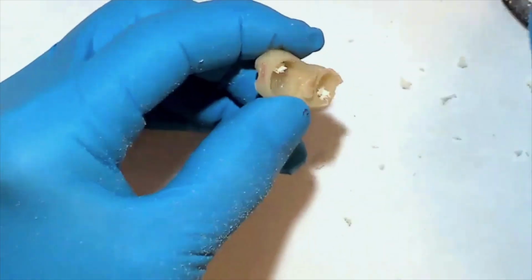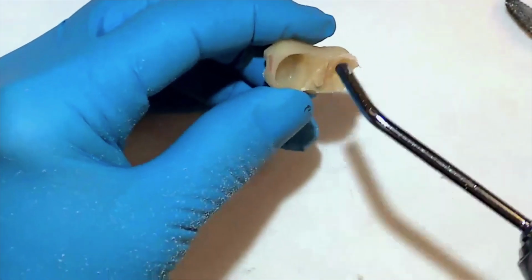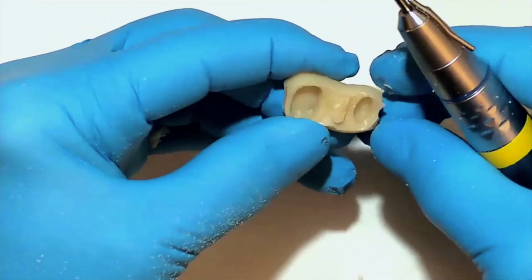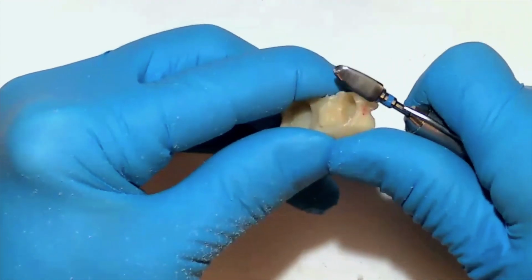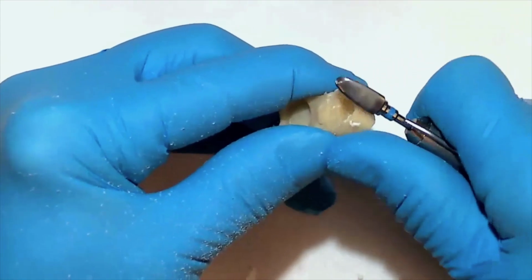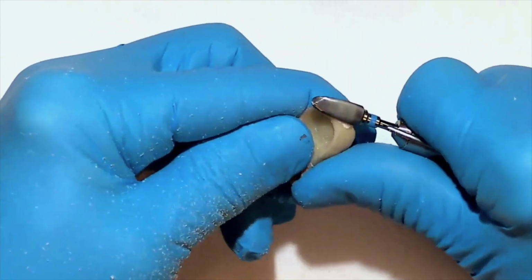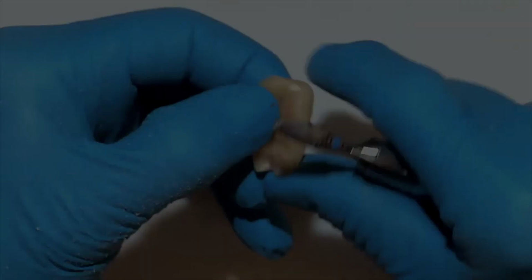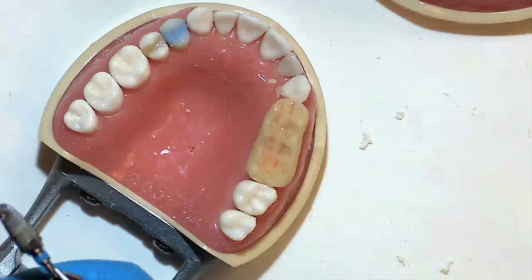We're continuing our carving here, going slowly as to make sure we avoid damaging the margins and also avoid compromising the occlusal contacts on the supporting cusp and the guiding cusps. Here's a picture of it now in place in the mouth.